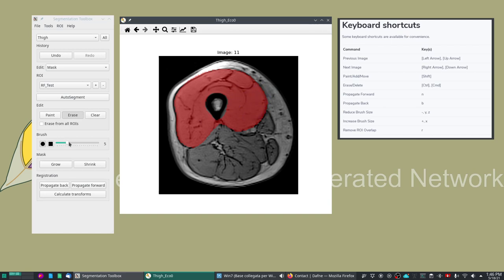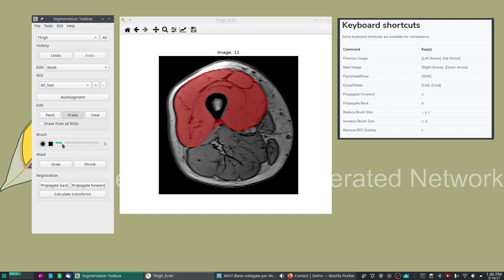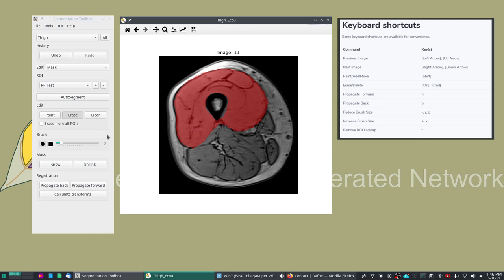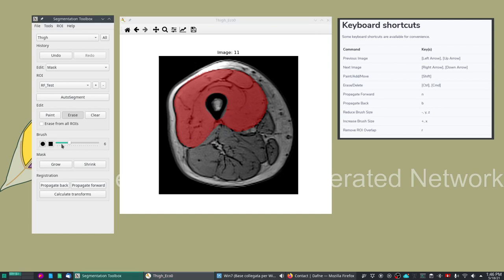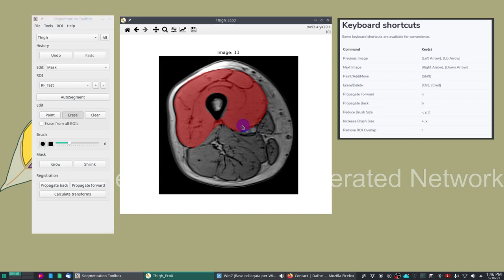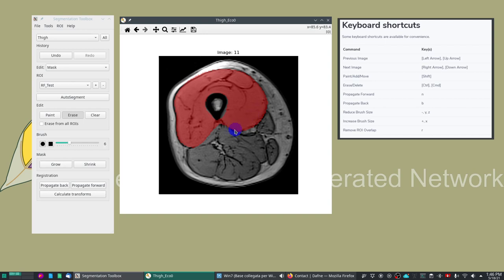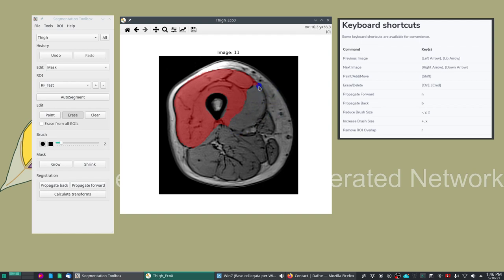We can change the size of the brush with this slider here and we can change its shape as well. In the round this indicates the radius, in the square this indicates the size. In addition to using the slider we can also use keyboard shortcuts and these are useful if you want to do initial gross modifications and then do much more fine-tuned modifications.